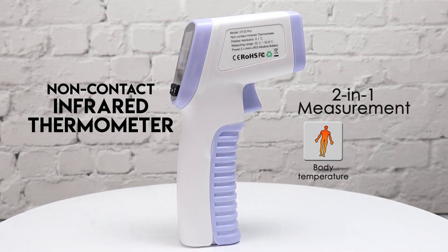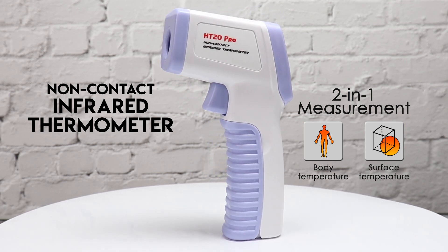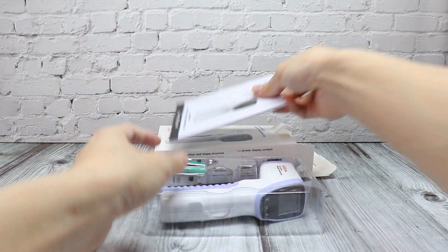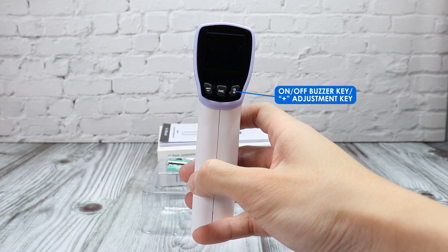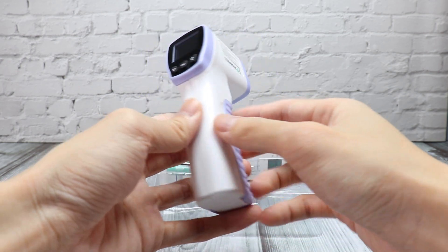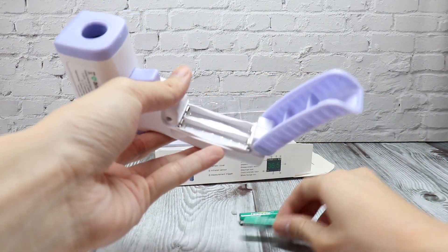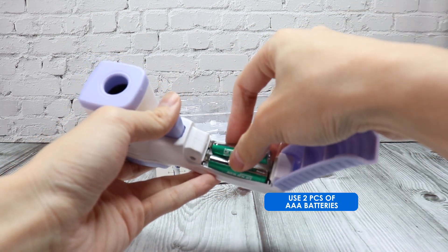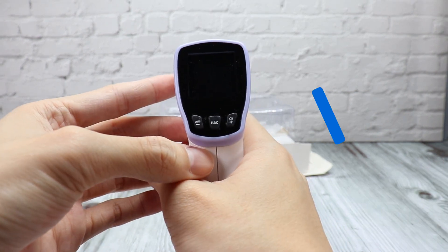This HT20 is a 2-in-1 body and surface non-contact thermometer. To operate, open the battery cover and load two AAA batteries. Pull the trigger to start up the meter.